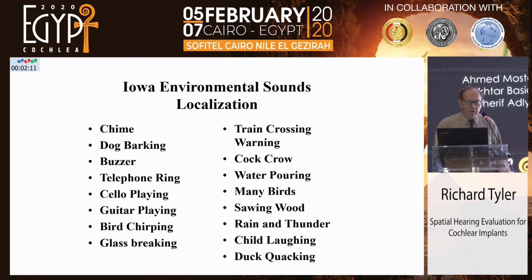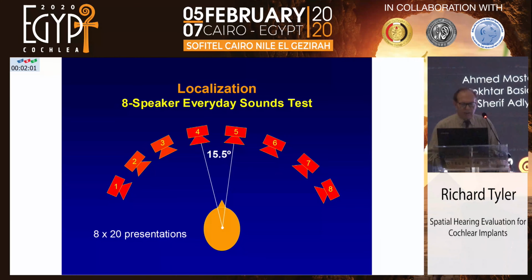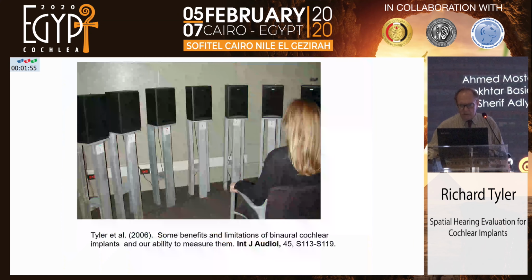So our environmental sound localization test includes dogs barking, water pouring, birds, ducks, lots of different environmental sounds. We start off with a localization test using 8 loudspeakers, and here's an example of how that was implemented.